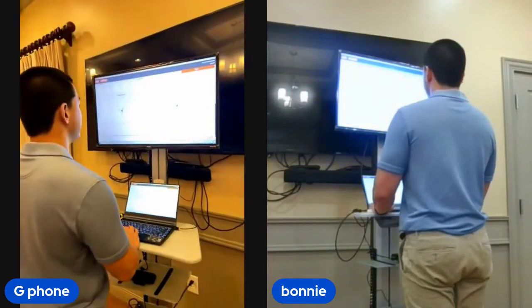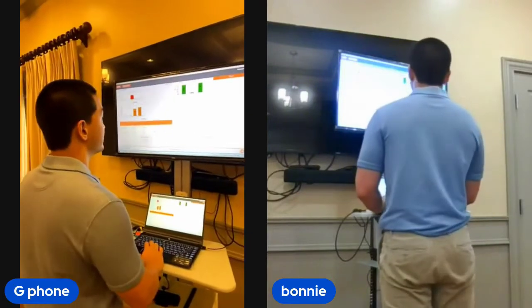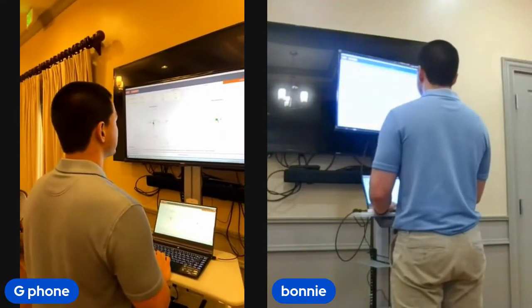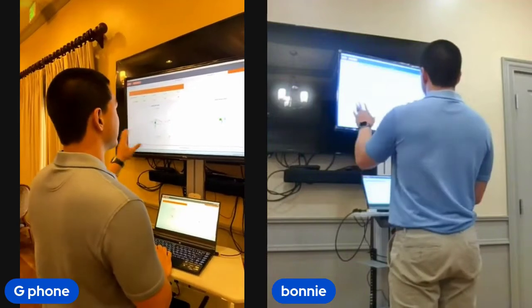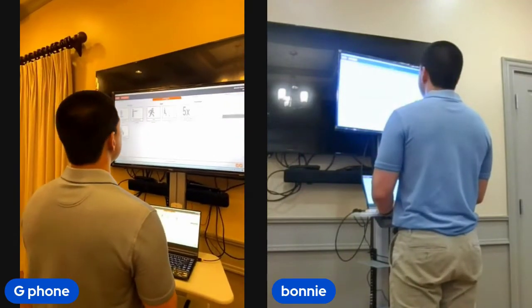And like I said, it'll give you that graph. And later I can print this out and maybe compare in the next few weeks after we've worked on their balance and see what this looks like in a couple of weeks, see if we're making any improvement. There's another test or two.